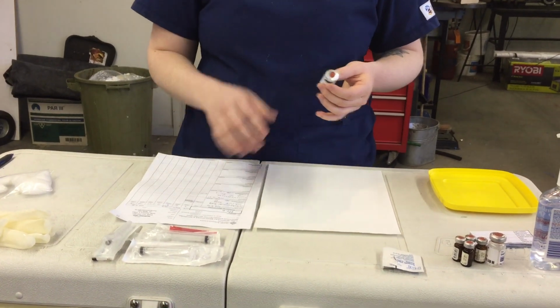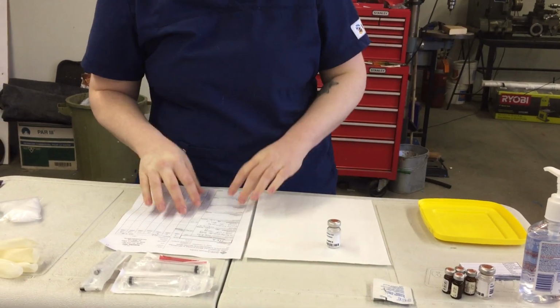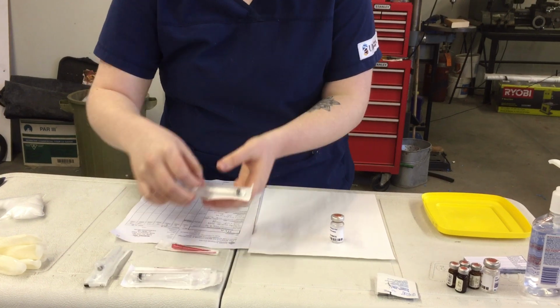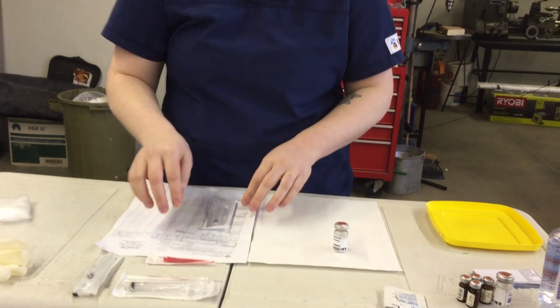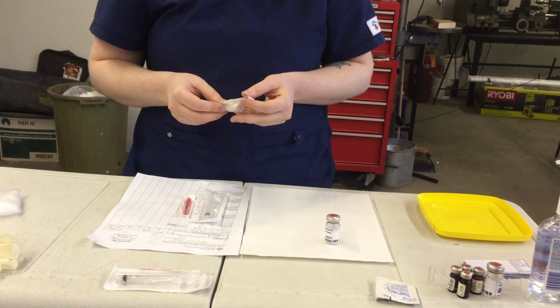After I've done all of that, I'm going to wash my hands, and I'm going to grab my right supplies here. I'm going to be using a 3 mL syringe because I'm going to need 3 mLs of this medication for the right dose. That's correct. I'm going to get a blunt fill needle, and I'm also going to get my correct injection needle.